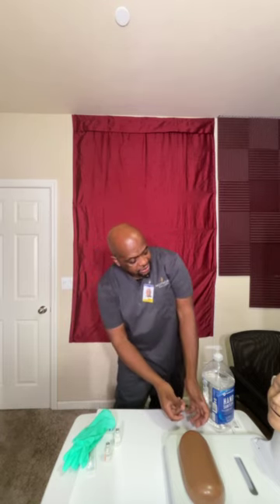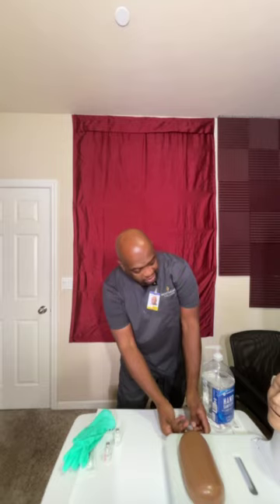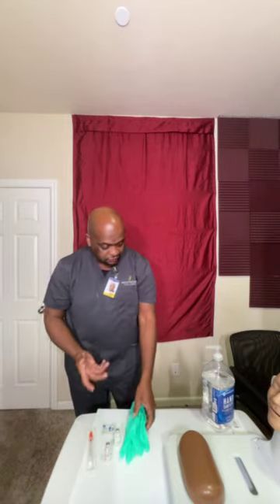Mr. Jones, can I please check your wristband, and as I'm checking your wristband, can you please verbalize your name and your birthday for me, please? Okay, your name is Raymond Jones, birthday March 10th, 1965. Thank you, Mr. Jones. As I explained, I'm here to give you insulin. So before we actually do that, I'm going to first check your blood sugar. So I'm checking Mr. Jones' glucose level. Check those, right? It's at 168. So yeah, we're going to actually give you that insulin.